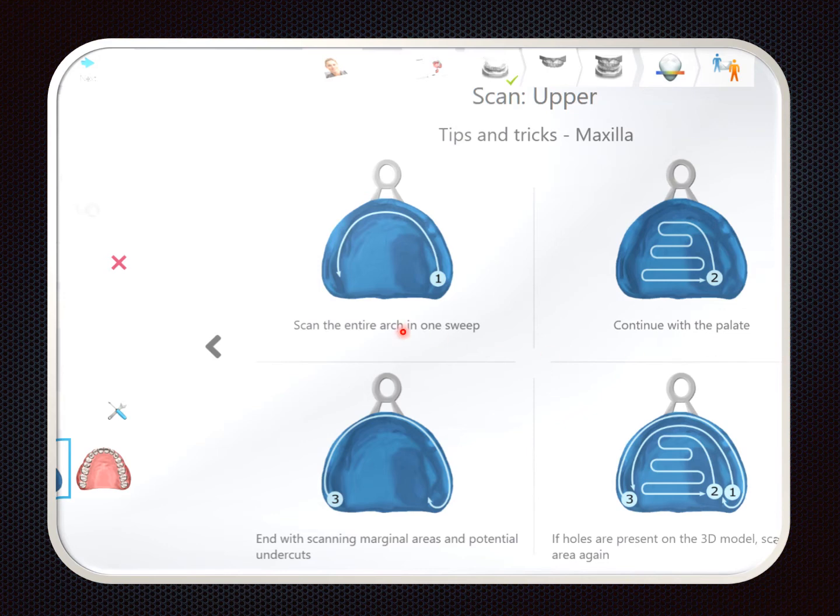This is the recommended scan strategy: a pass across the ridge, scanning back and forth over the palate, then a pass across the depth of the sulcus. After that is all recorded, look for any gaps or holes — the deep areas can be hard to capture and may need to be re-scanned. I add a fourth pass in this case because it's not simply an impression but a denture holding the impression, so I capture the buccal surface and the teeth.